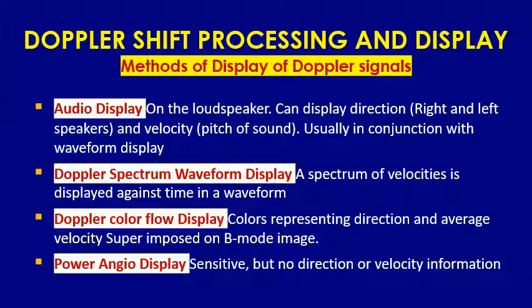The Doppler spectral waveform that uses the fast Fourier transform technology also displays the audio with it. Audio comes with the speakers. We have right and left speakers. Usually the right speaker operates with the flow toward the transducer, which is a positive shift, and the left speaker operates with the flow away from the transducer.